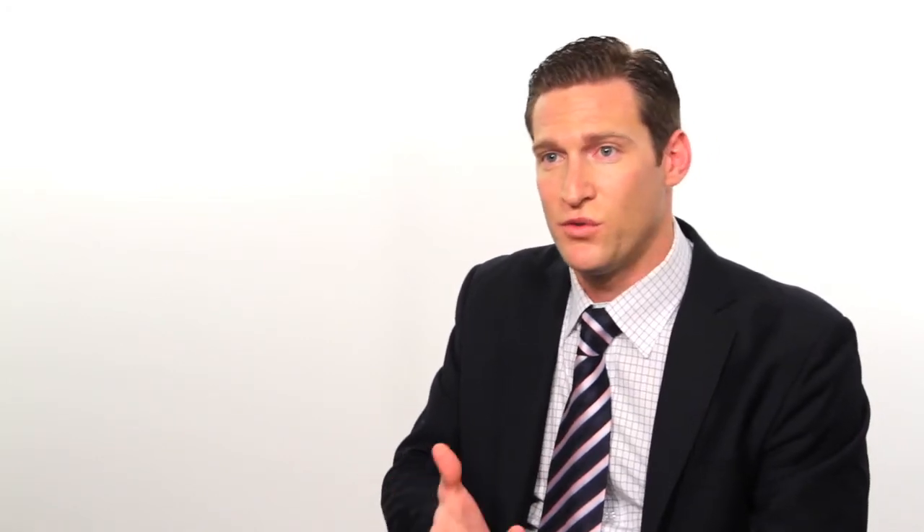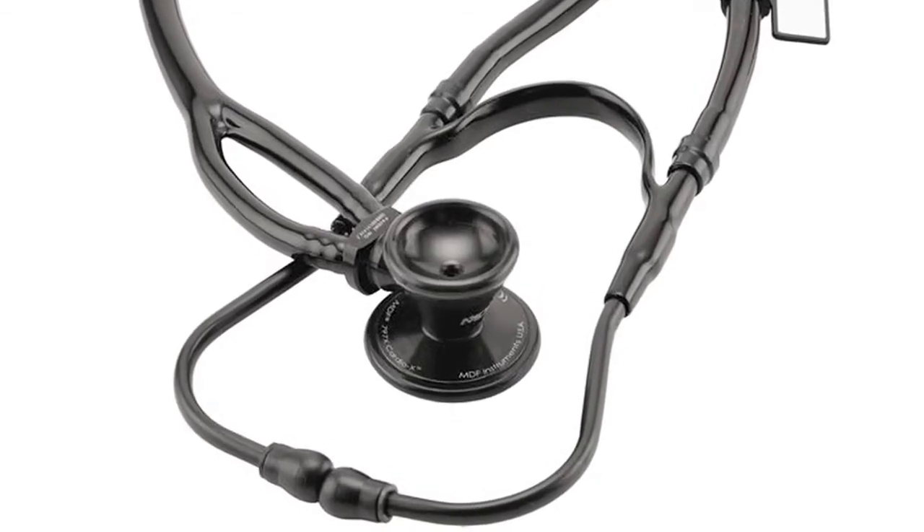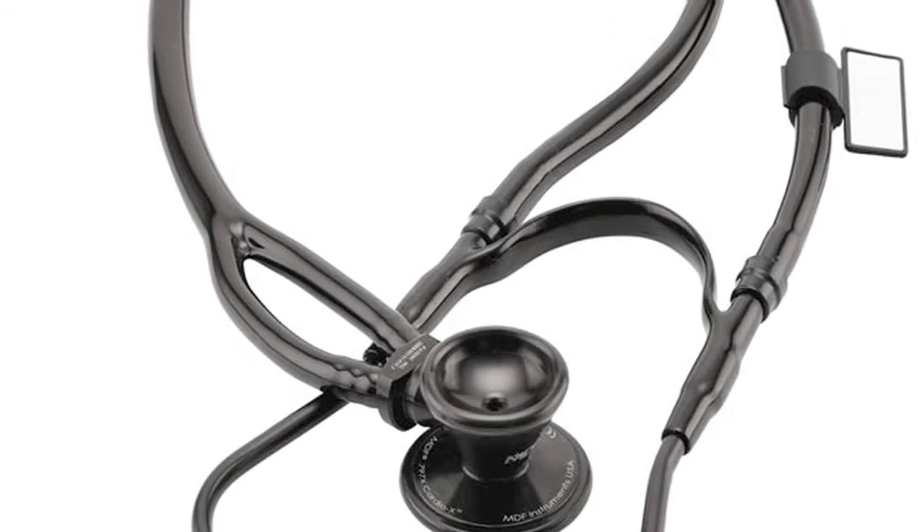The CardioX contains a number of patents, which include the first-ever dual-output acoustic valve stem on a cardiology stethoscope. This means that there are two uninterrupted sound channels that travel all the way from the chest piece to the ear tips. The CardioX also contains the patented MDF Glidelock system, or GLS, which activates sound channels while eliminating any sound loss due to leakage.